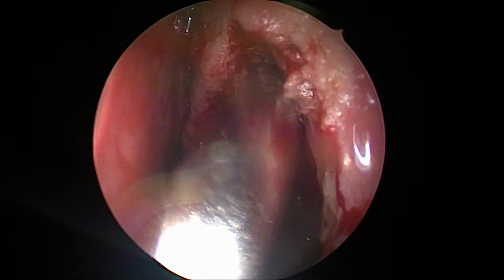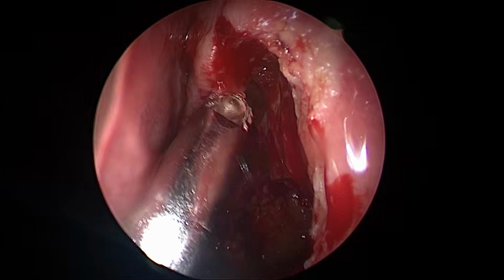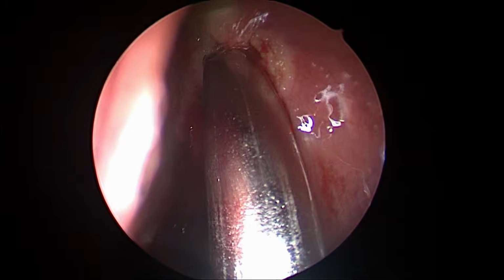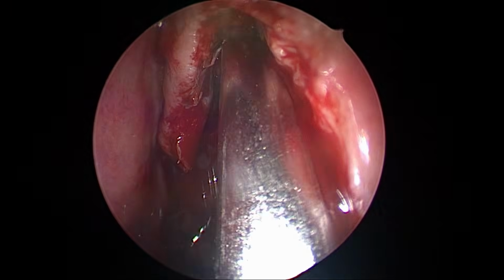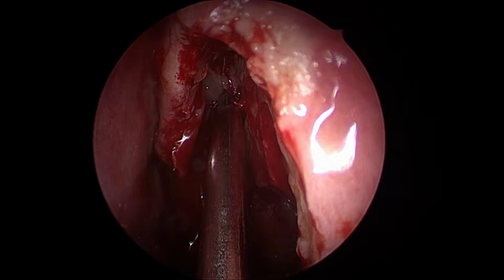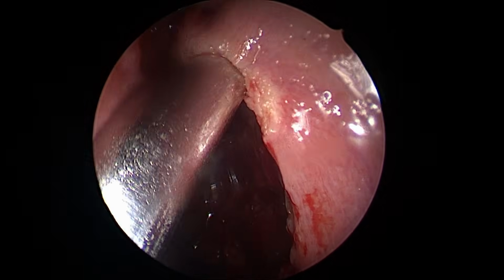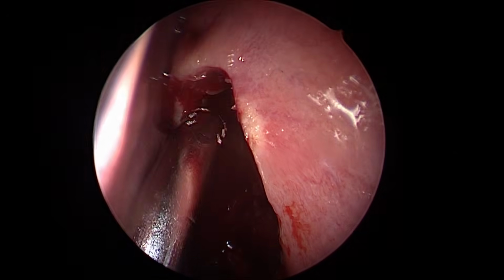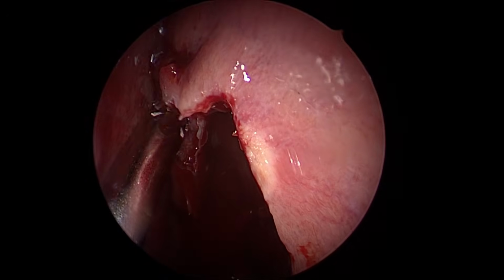Now, coming above, I told you the way I am going to show you. I would love to know from you that the frontal sinus is the easiest sinus to deal with if dealt with properly. See now what I am doing, because God has given us a great landmark. I am removing this beak adequately. See this beak? Oh, sorry, this agger. See the agger region?